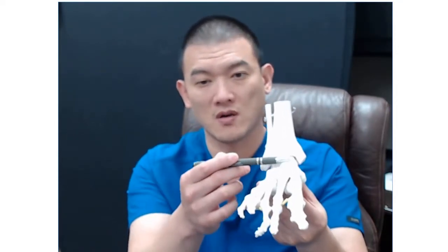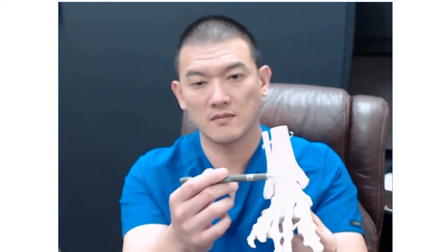What is synovitis? You have articular cartilage on the talus as well as the tibia. So that's the talus, that's the tibia, that's the fibula.